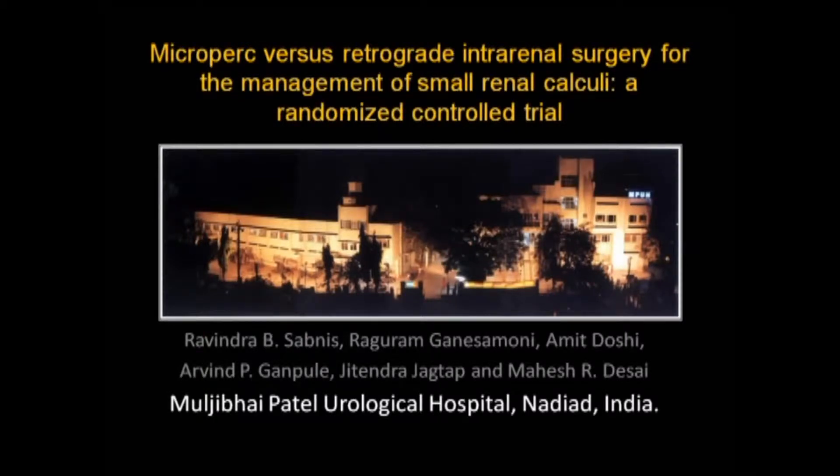We conducted a randomized control trial comparing microperk and retrograde intrarenal surgery for the management of small renal calculi. In this video, we describe our technique of microperk initially.